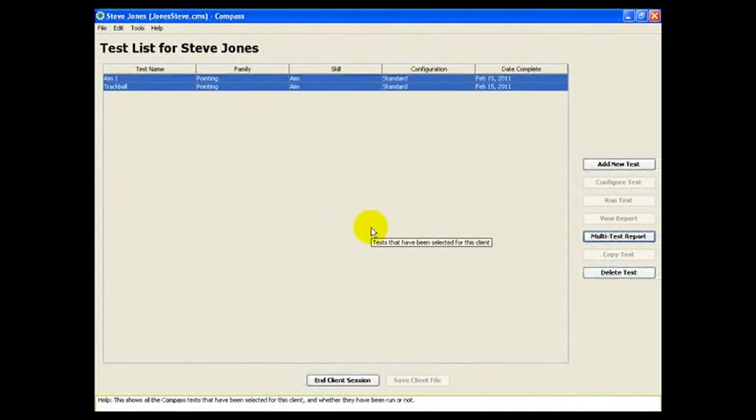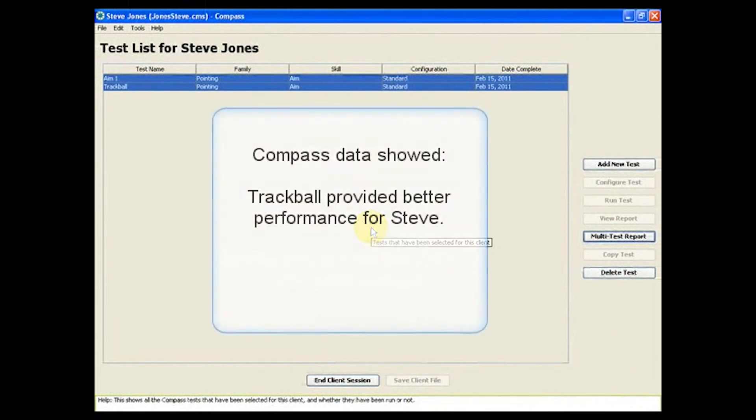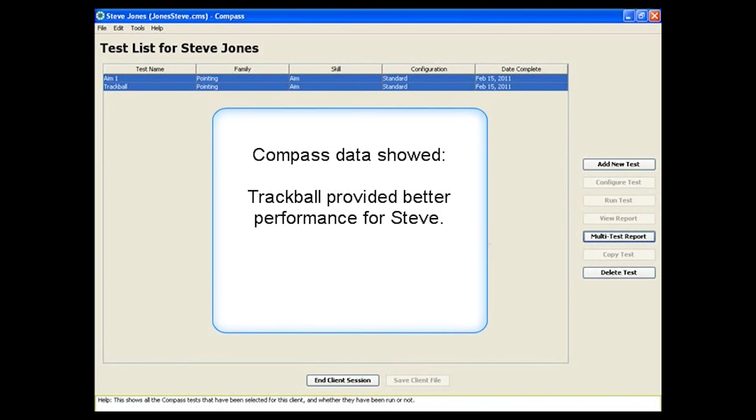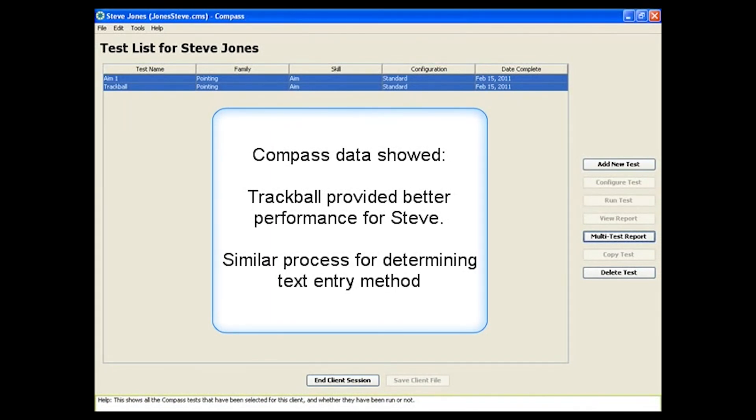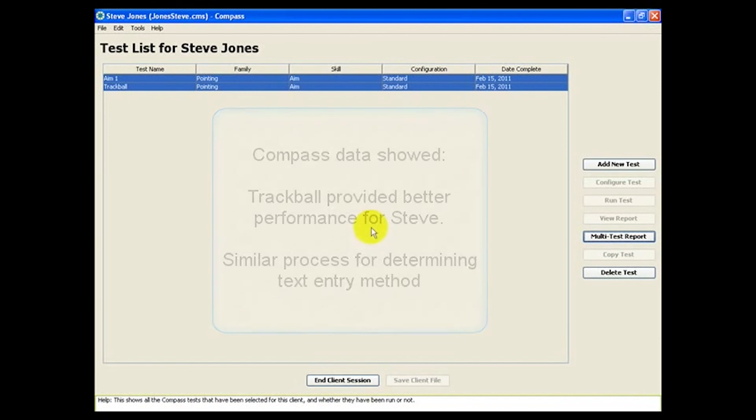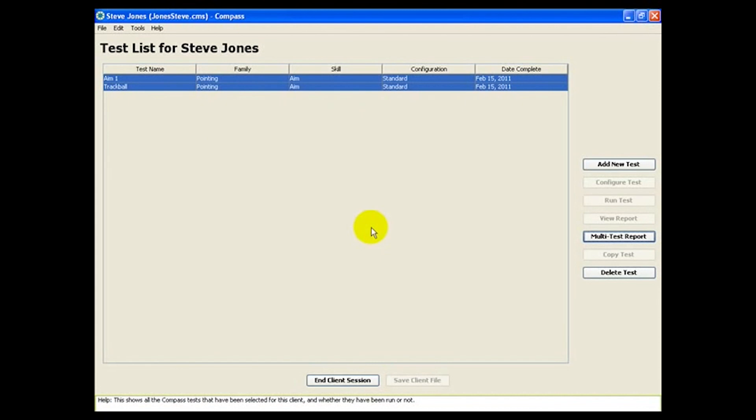And that's it for our overview. We've demonstrated how to use Compass to make decisions about pointing devices. Similar principles apply to examining text entry and switch use as well. Thanks a lot for watching!